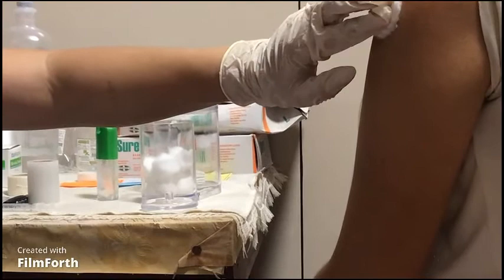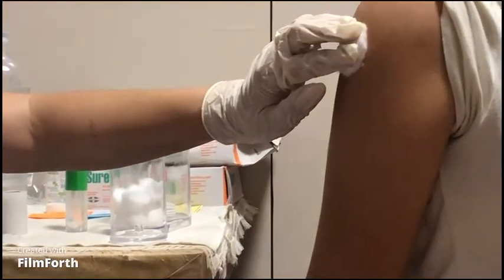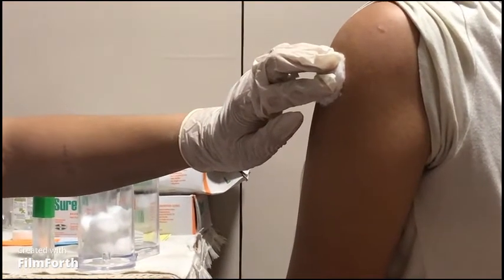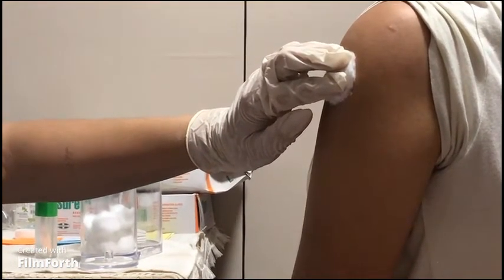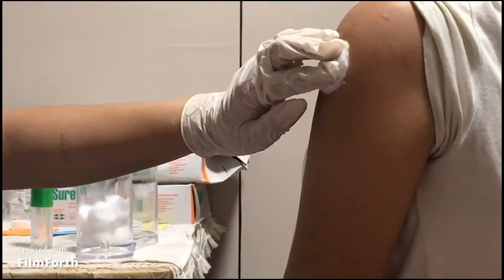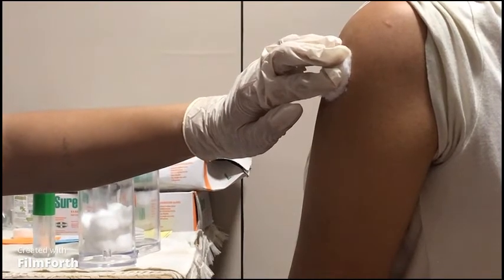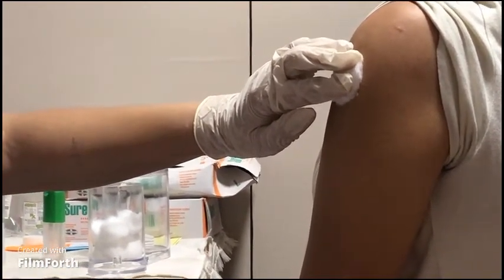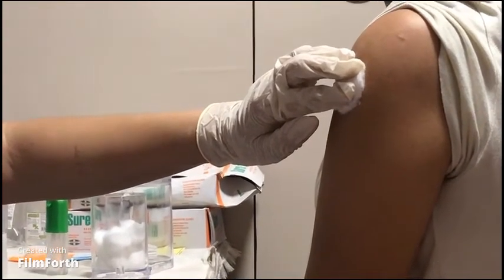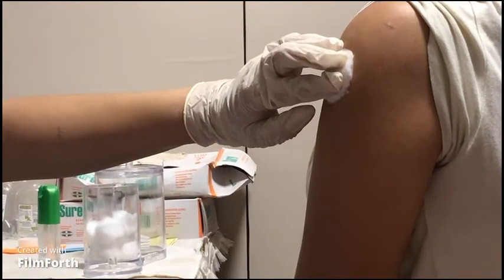Holding the syringe between the thumb and forefinger, pierce the skin quickly and smoothly at a 90-degree angle and insert the needle into the muscle. Hold the barrel of the syringe steady with your non-dominant hand and aspirate by pulling back on the plunger with your dominant hand. If blood does not appear, inject the medication steadily and slowly by holding the syringe steady. After injection, wait 10 seconds.